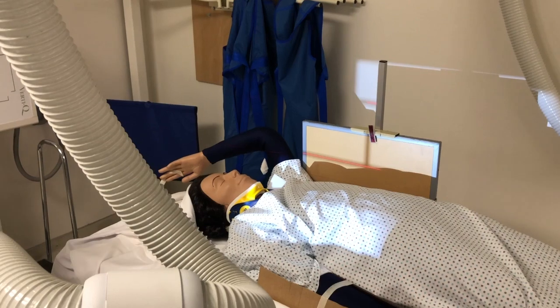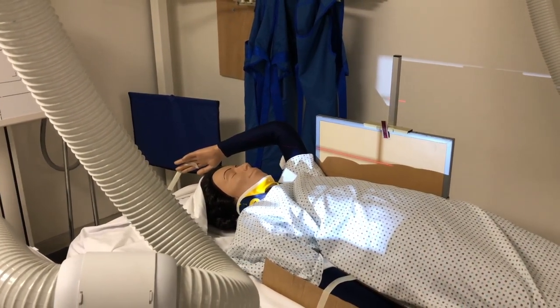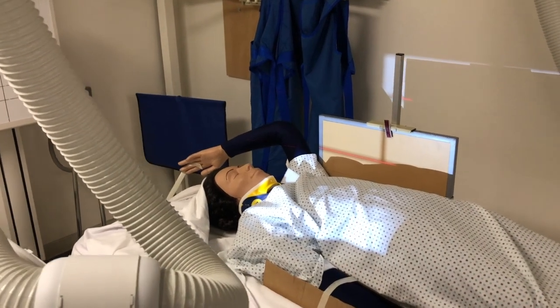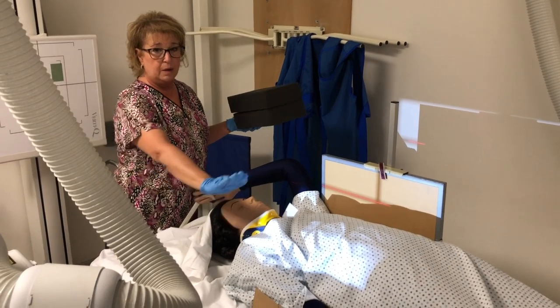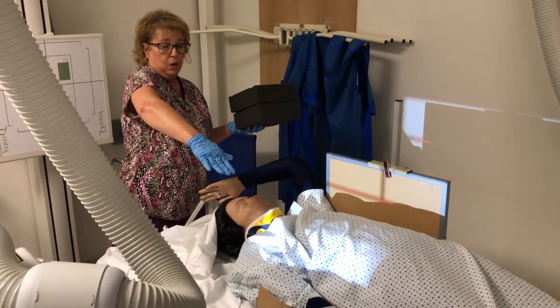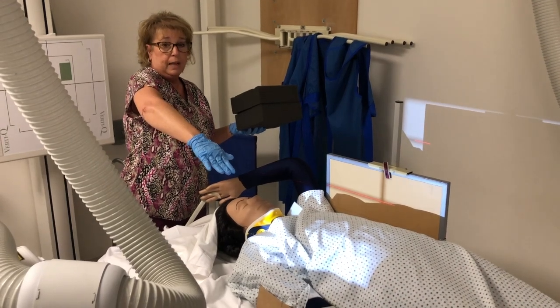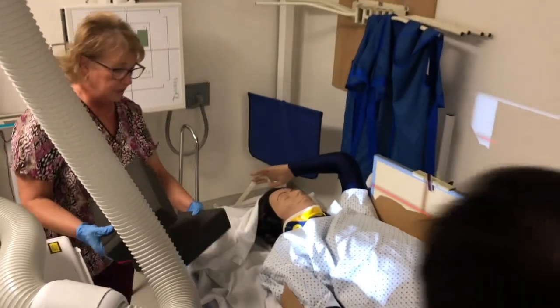Now, what to do with her broken arm? If you think about it, the thoracic spine is at the very posterior part of the body. So if I'm able to elevate her shoulder and her arm just a little bit, I should be able to clear the back of her body. So that's what we're gonna do here.